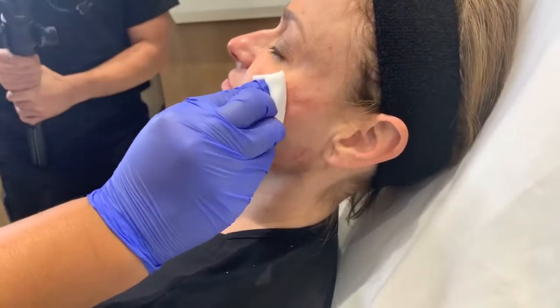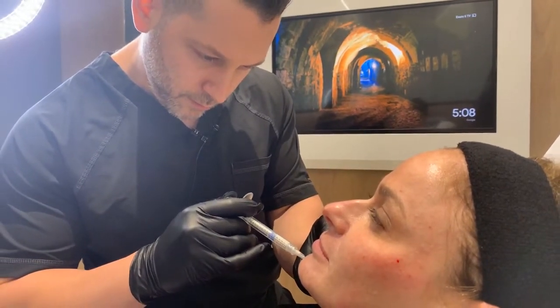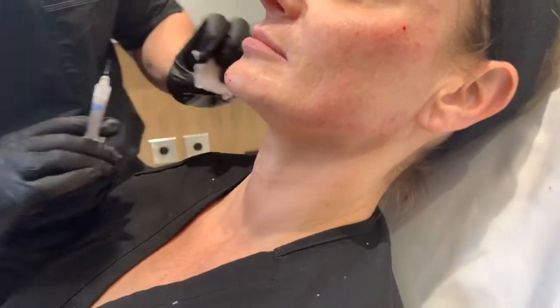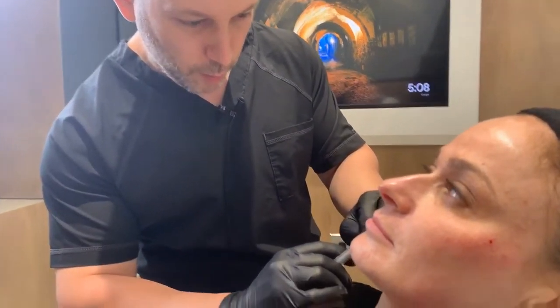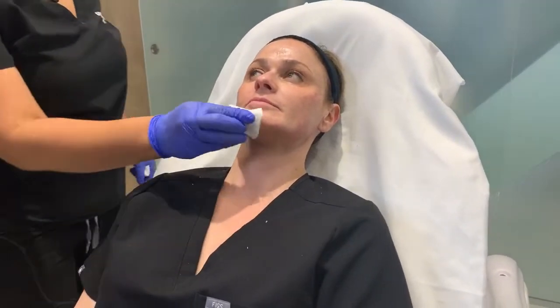Let's switch with you guys. We're doing a little filler dance. And any bruises, you guys, can be covered with makeup. We're going to do just a little bit onto the fold. And remember, one of the first fillers we ever did in clinical trials, besides Restylane, was actually a Radiesse mixing study where we had Radiesse for folds. It was very safe. And the right person, it looks great.